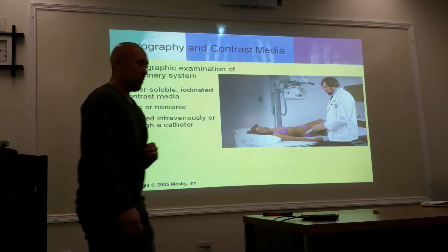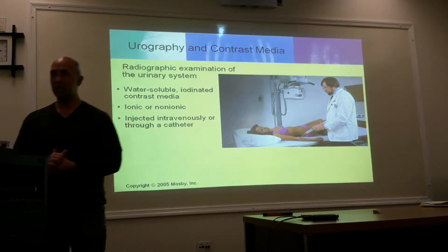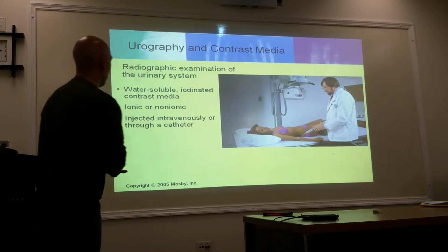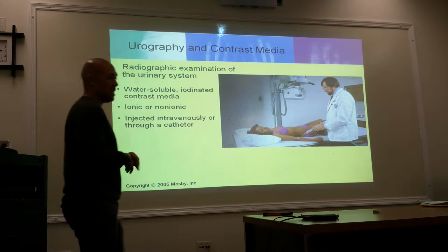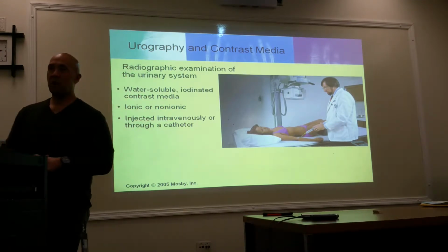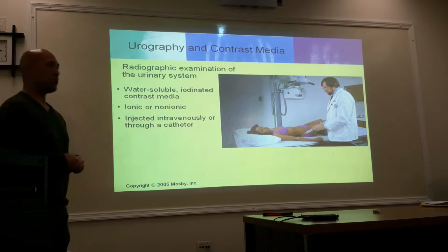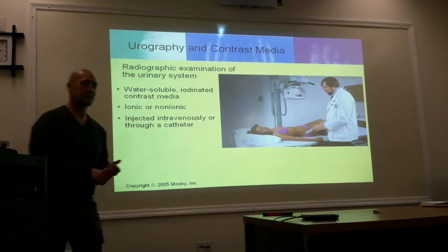So let's talk about now the procedures that are done on the urinary system. So urography is the generic name of the study. This is a radiographic examination of the urinary system. We are going to be using water-soluble iodinated contrast.